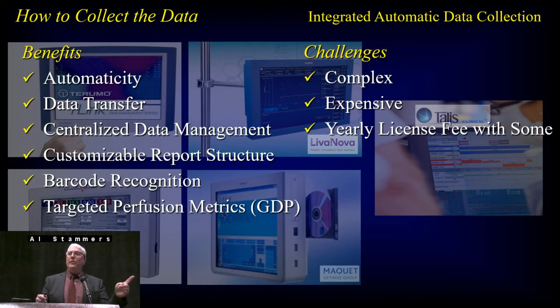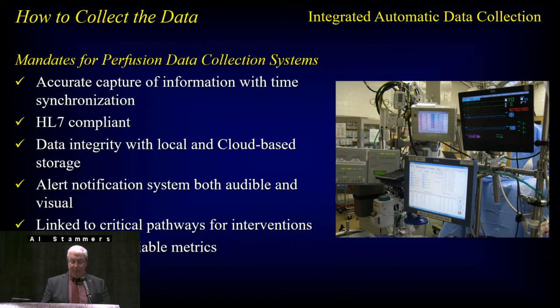He just spoke with Germany, where we just happened to use the Sorin, because of all the problems associated with getting the system to work. It is not plug and play, and none of these are today. They do take some work, and of course they are expensive.